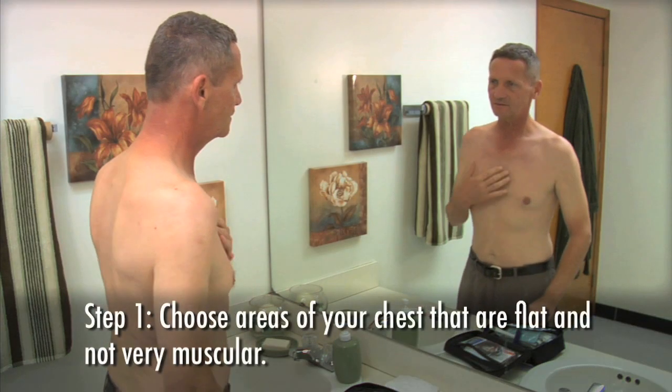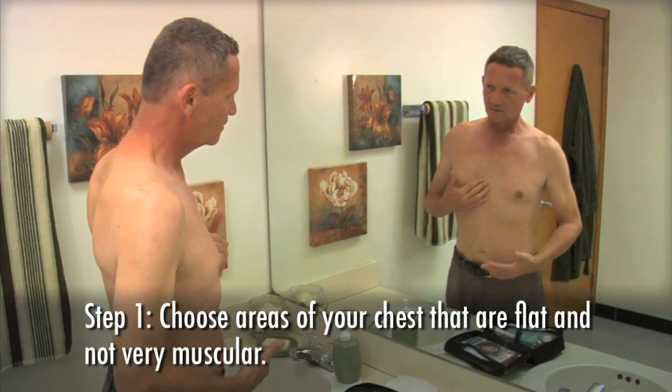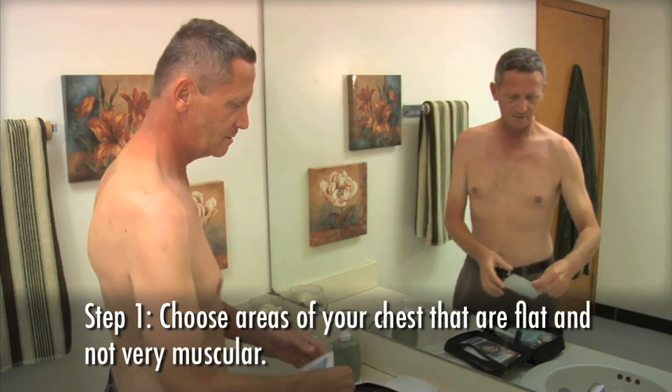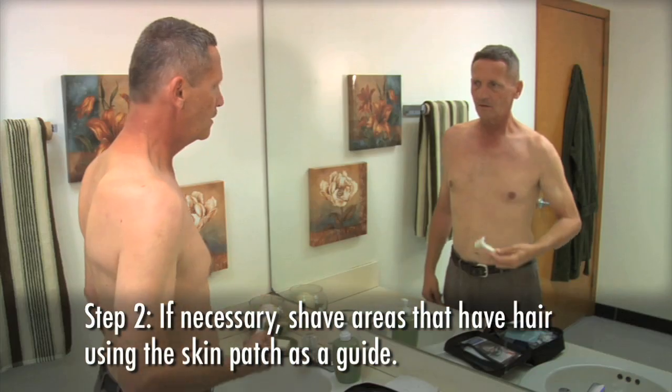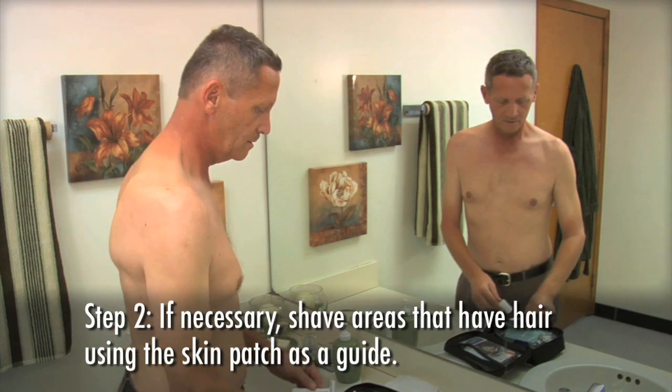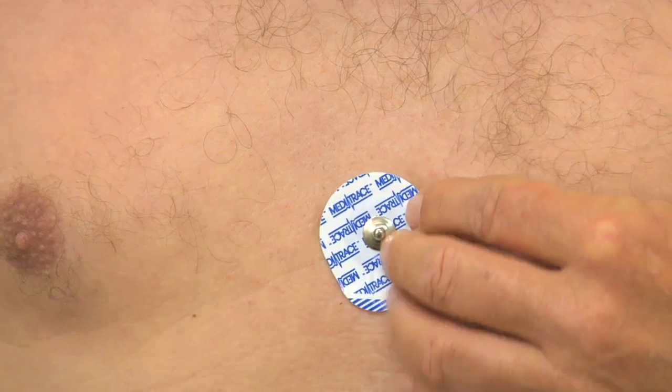Step 1: Choose areas of your chest that are flat and not very muscular. Avoid skin folds or creases, irritated skin, or scar tissue. Step 2: If necessary, shave areas that have hair using the skin patch as a guide for the size of area to shave. This ensures good contact and makes electrode removal much easier.